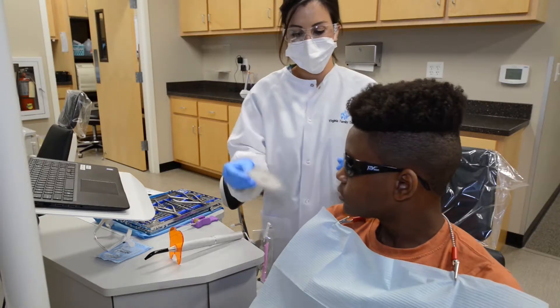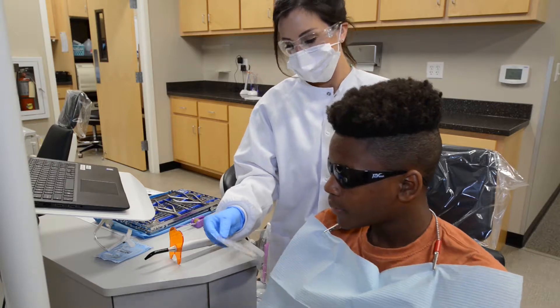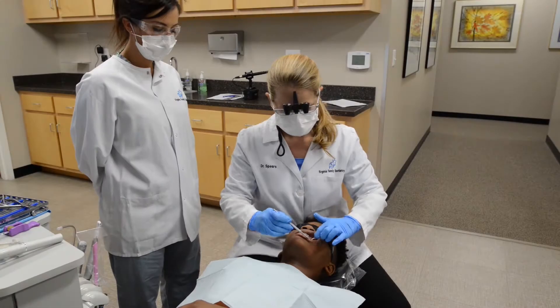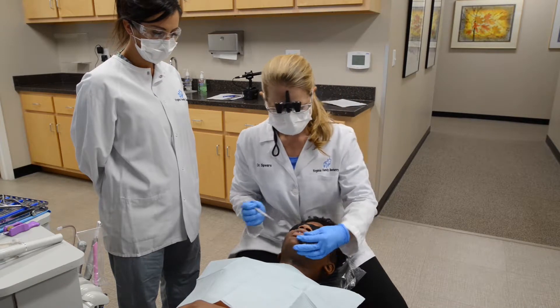Now comes the fun part. Your child will be able to choose his or her bracket colors from our selection. After the colored bands are on, the orthodontist will do a final check, and we are done.